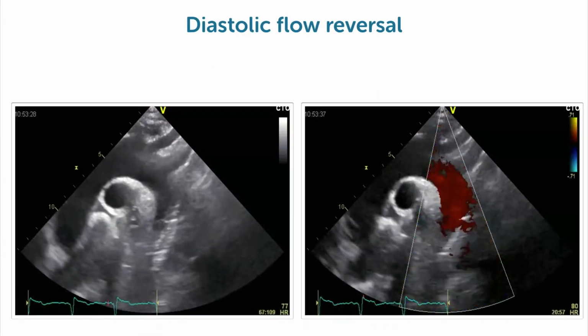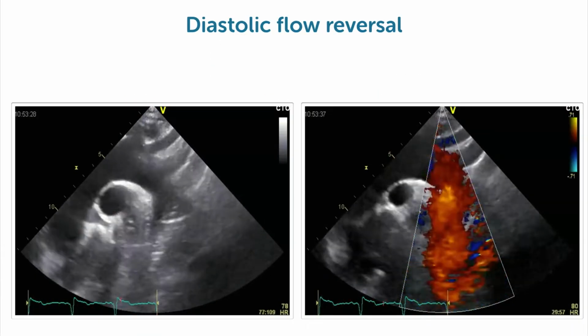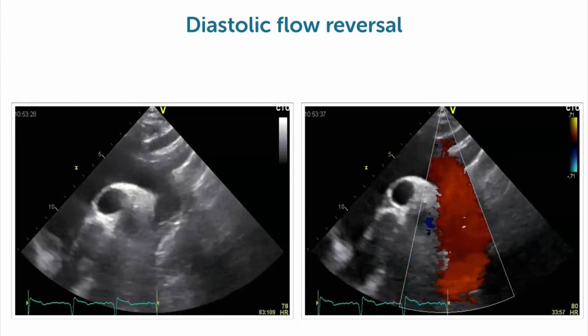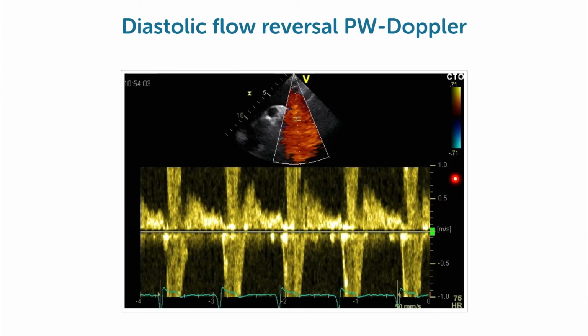Yes, and if you look at the pulsations of the aorta, they're very vigorous, which means that the aortic regurgitation is probably severe. This is an indirect sign. Now, if you put the pulsed wave Doppler somewhere right here, you will get a spectrum that looks like this. And again, consider diastole. So you see most of this reversal flow happens during the early diastolic period, but stays high. Well, Anna, I think we have to stop here because we're going into too many details that we actually want to show you in the masterclass.